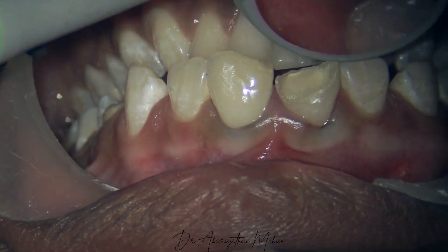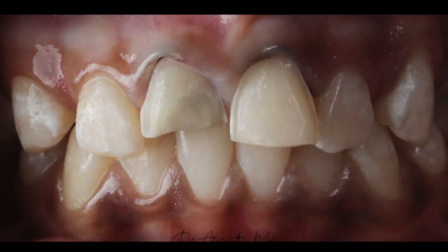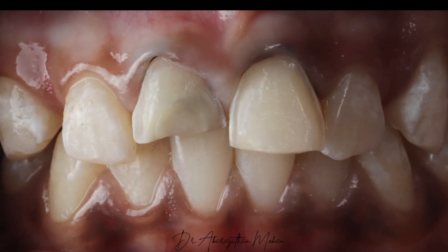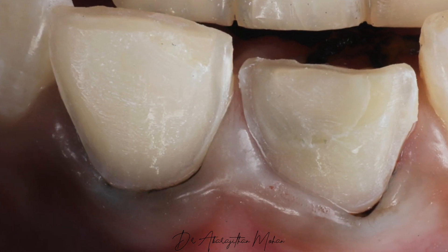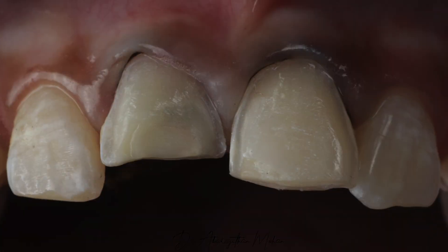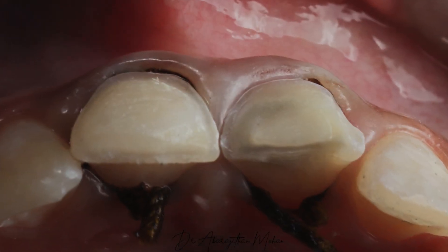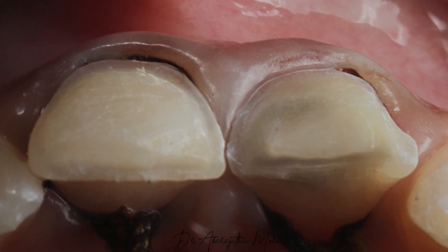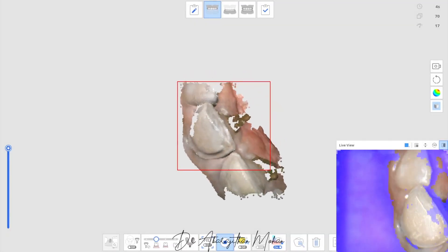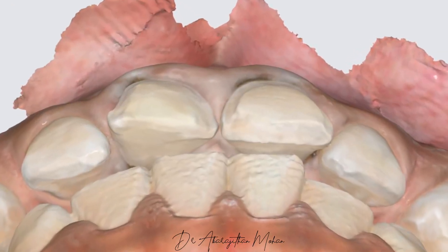And that's it. Now when I do the preparation, I will be able to place the margins nicely — equigingival or even a little subgingival — but still not damaging the gingival. The bur has not lacerated the gingiva in any way, but still I've been able to place a good margin. You can see the lateral displacement, so it's very easy for my impression method, be it the digital method or even analog impression materials, to record the margins nicely.